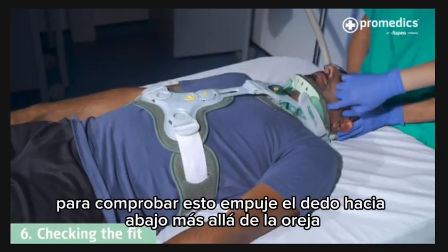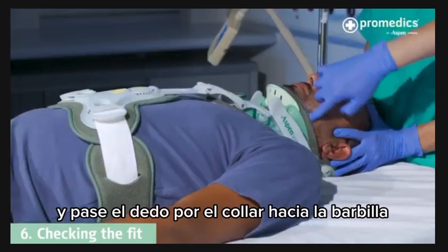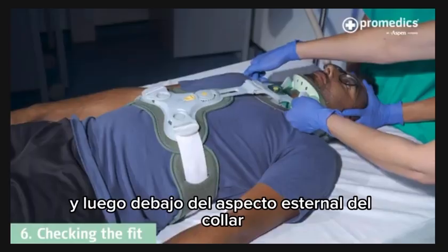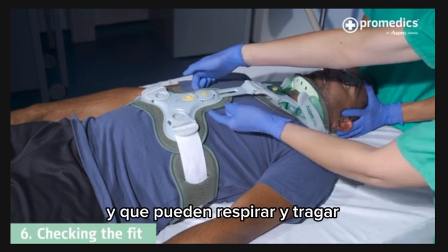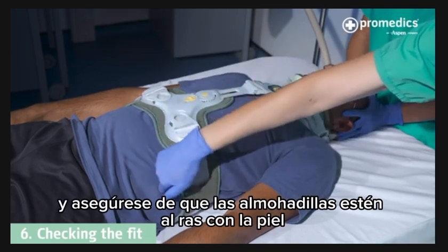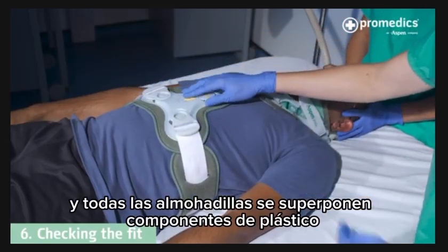To check this, push your finger down past the ear, behind the mandible, and run your finger along the collar towards the chin and then underneath the sternal aspect of the collar. Check the back of the chin piece is not pressing into the patient's throat and that they can breathe and swallow. Run your finger around the lower section of the brace and ensure the pads are flush with the skin and all pads overlap plastic components.